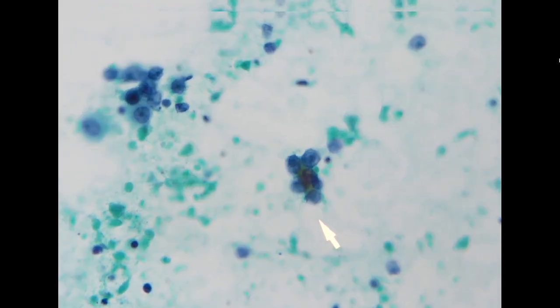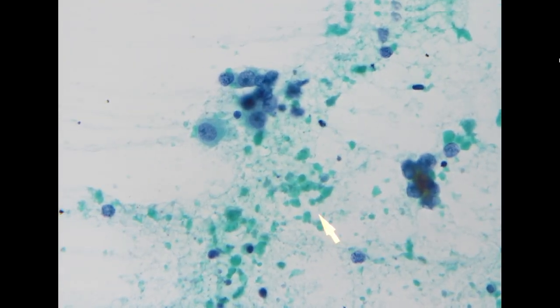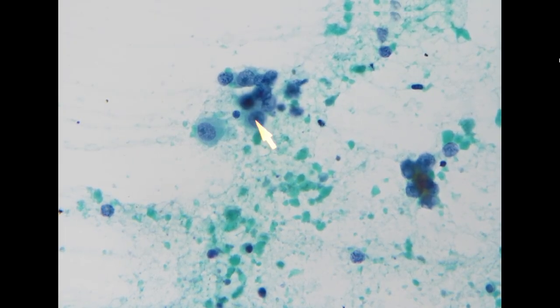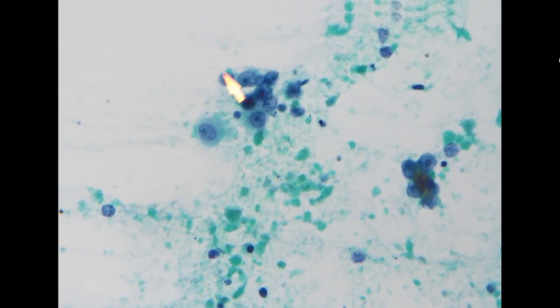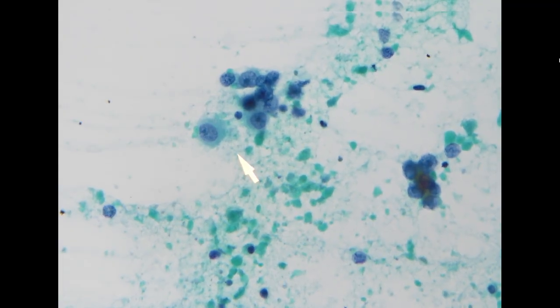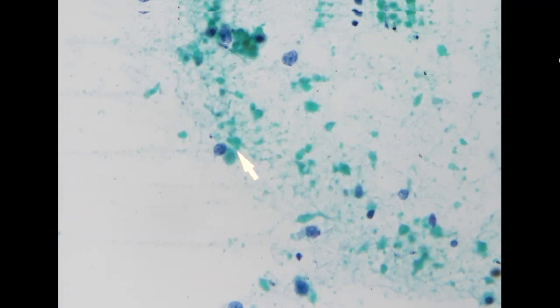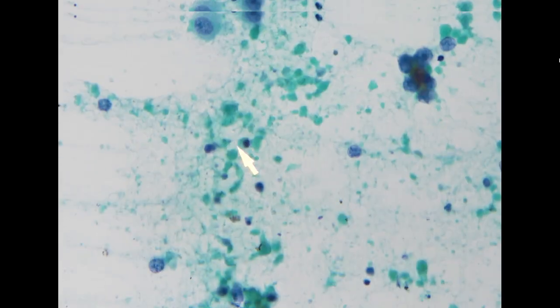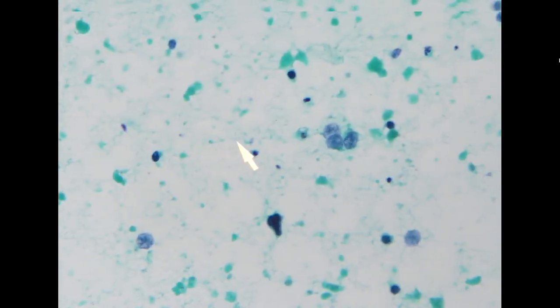However, for the cytomorphology here, these cells in the smaller clusters demonstrate a very rounded nucleus instead of an elongated, palisading type of nucleus that we can see in colorectal cancer. So we go back to the history. The patient actually has breast cancer. So this is most likely metastatic breast cancer instead of primary lung cancer.